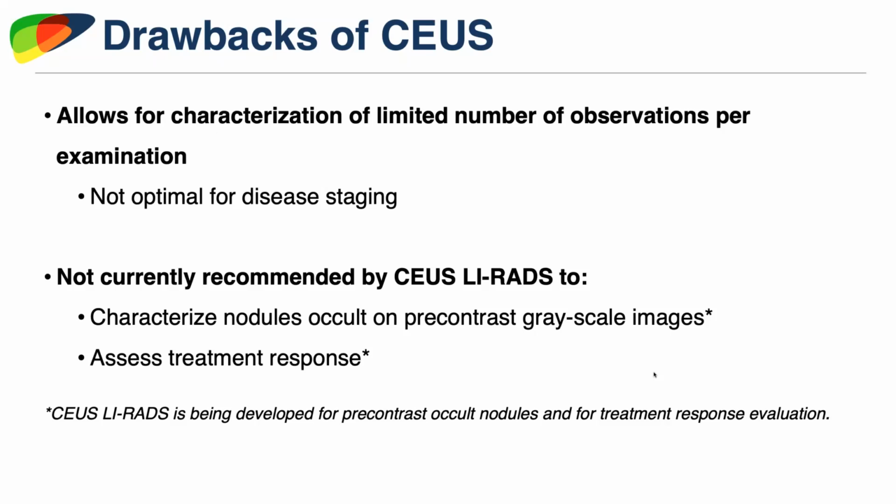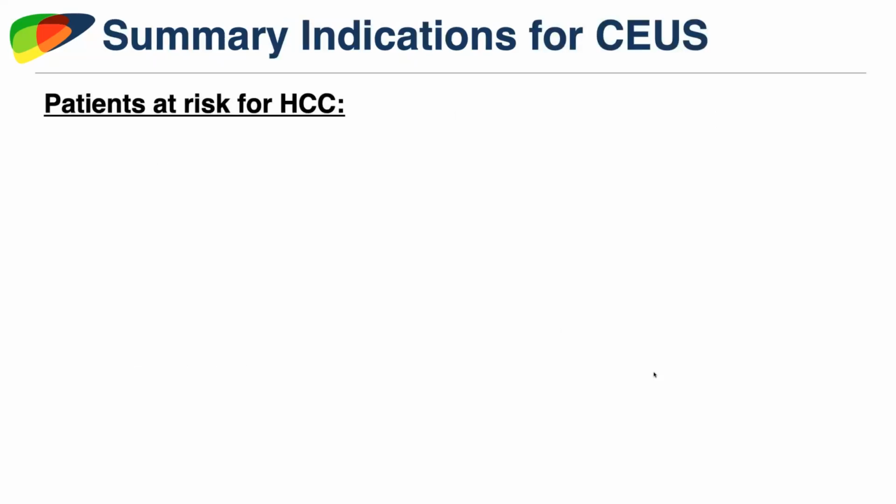Contrast-enhanced ultrasound LI-RADS is also not currently recommended for characterizing lesions not seen on a baseline grayscale study, and is not currently recommended for treatment response assessment. However, these two areas are areas of active research, and many of you have probably seen a lot in the literature on using this modality to assess response to therapy. And so I think in the next iteration of our LI-RADS, contrast ultrasound LI-RADS update, we'll have mention of these two issues.